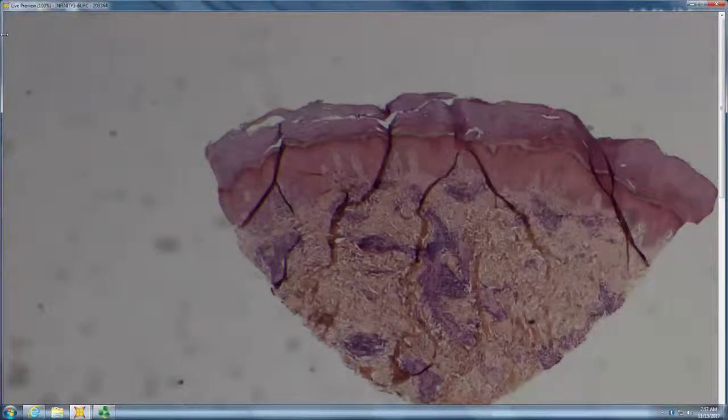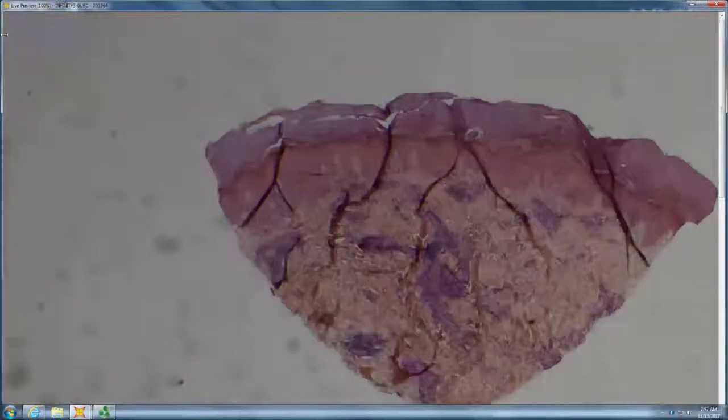And they're in tufts like stasis, and in fact you see a lot of background hemosiderin. So you've got a background of stasis, and you've got these hyalinized fibrinoid walls without real vasculitis. And some of them are so narrow, it's hard to see how any blood could get through.